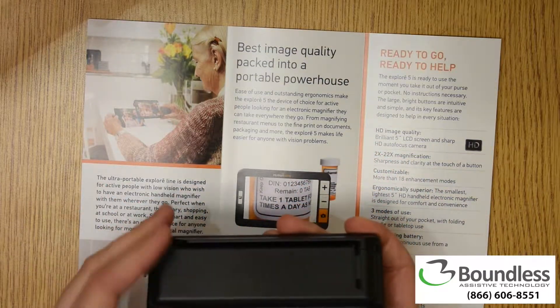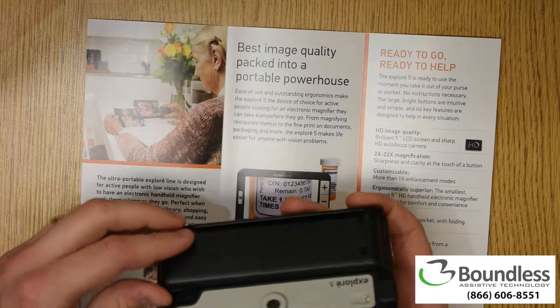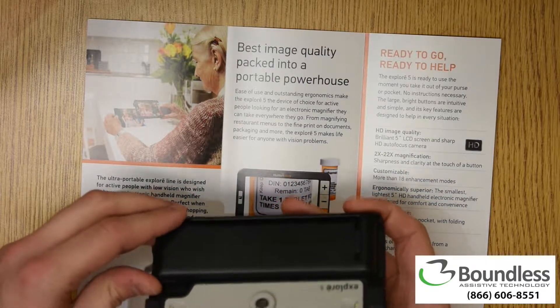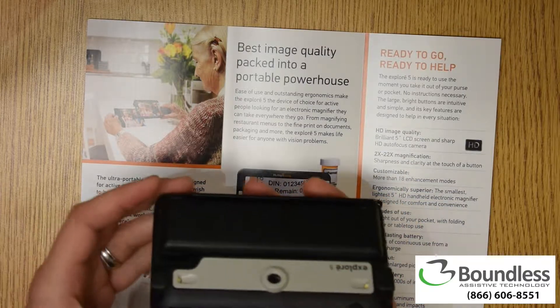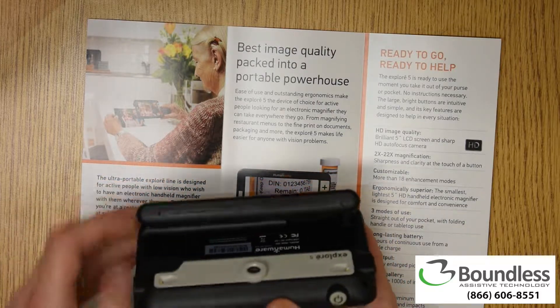What makes this product most unique is that it's able to support an ergonomic reading position where you can also rest the device on what you're reading. I'll go ahead and fold it out.